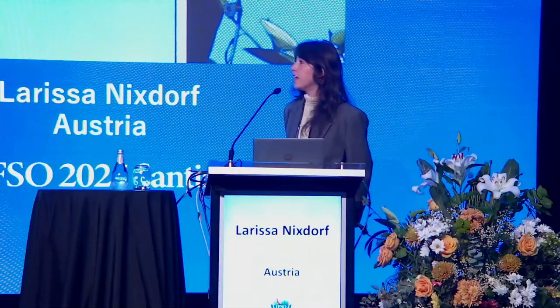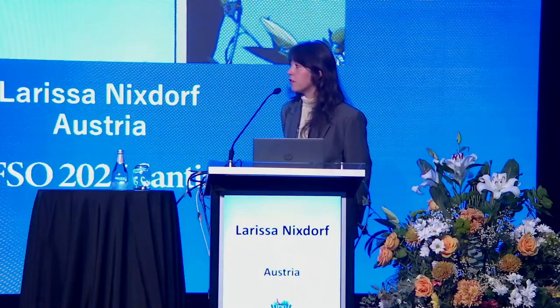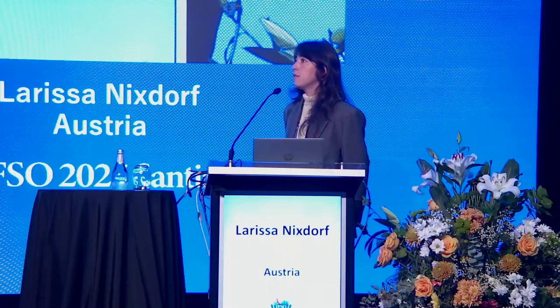So there are different ultrasound machines where you can include these 2 software programs. So you can include the measurement of the liver stiffness, so the point shear wave, into it, and separately also the measurement of the ultrasound-derived fat fraction. The actual cost of it, I have to say, I don't know. But you can include it when you buy a new ultrasound machine. Then I think the cost of the extra software might be bearable.